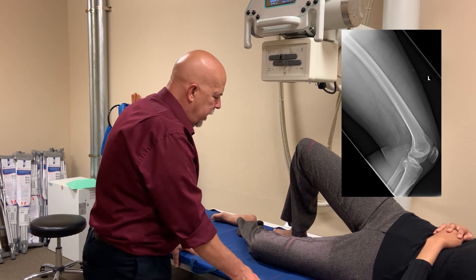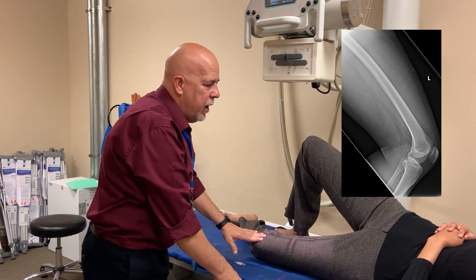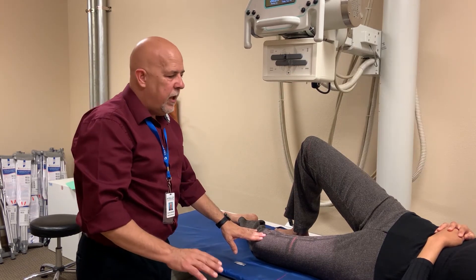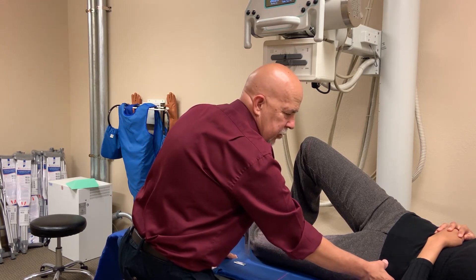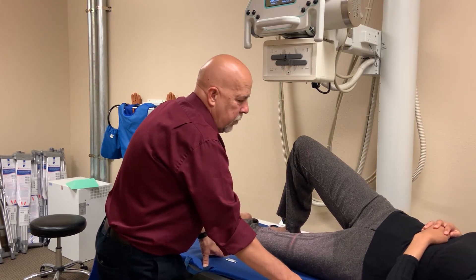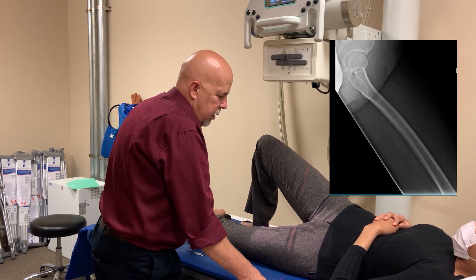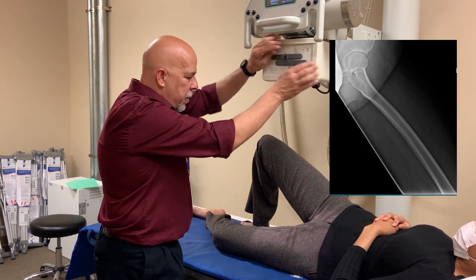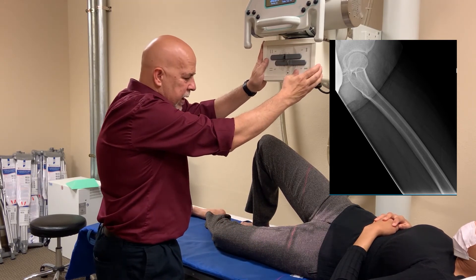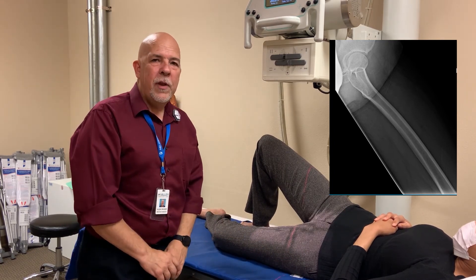Because we're already down here on this end, we can go ahead and do the lateral here. We're going to do the same thing for the lateral as we did for the AP — push on the ASIS, slide her into position, make sure we're appropriately marked, collimate appropriately, and make sure that your angulation is correct. Expose your image and you have an AP and lateral femur.